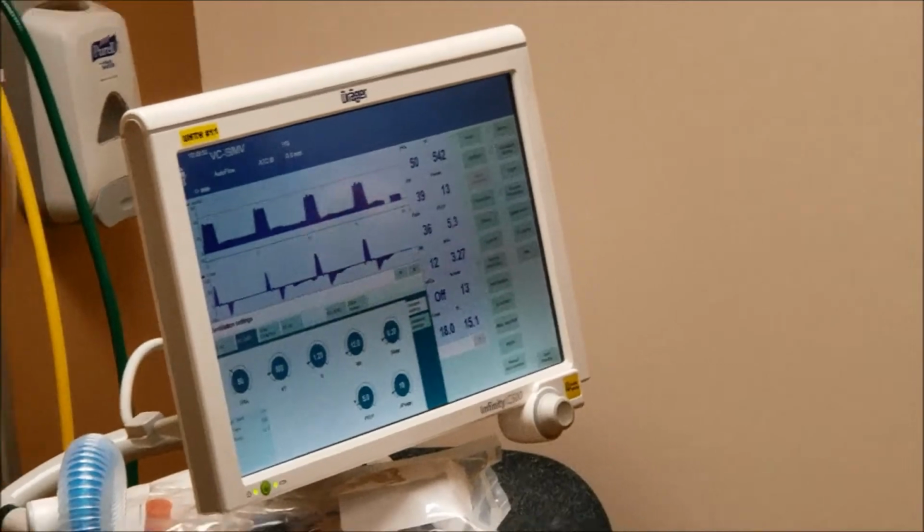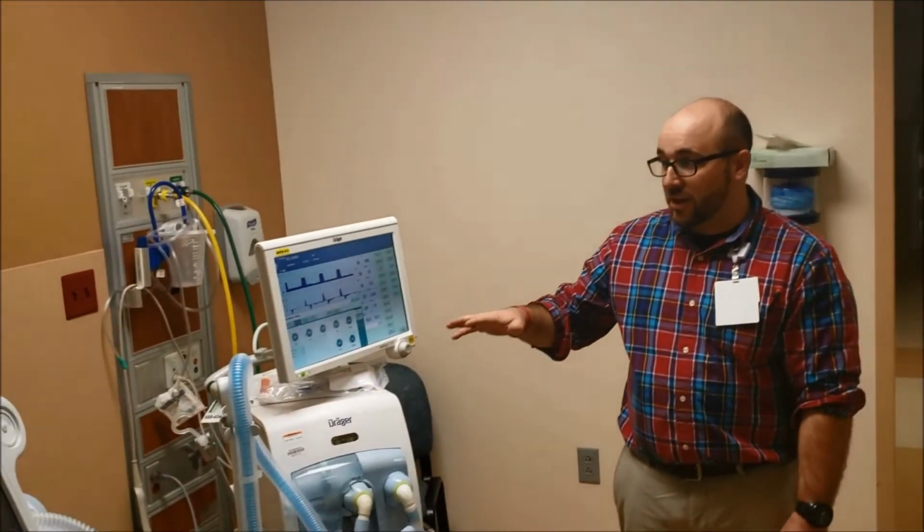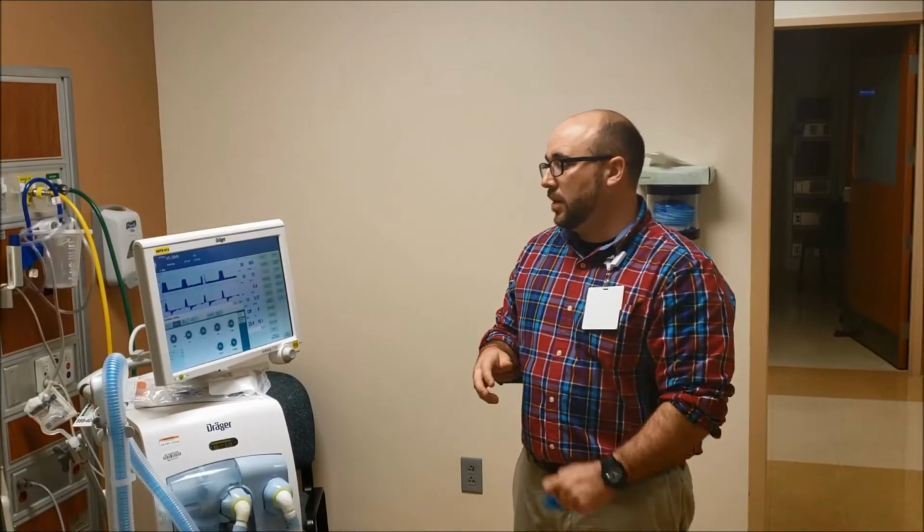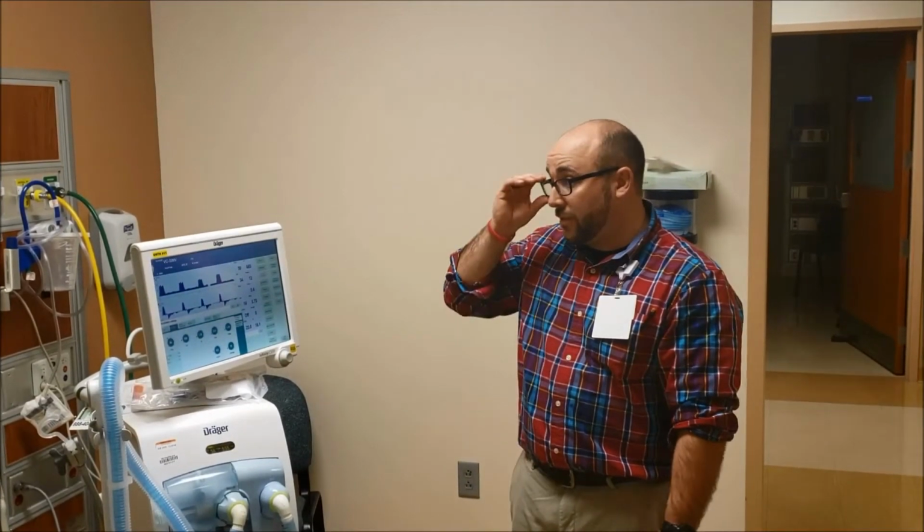If you happen to run this, if you started on your own, the RTs are coming down, honestly, in patient care, a PEEP of 8 is not a big deal. If they start on 8, it's not a huge deal to go back down to 5. But that's one change that you may have to make if you plug it in.